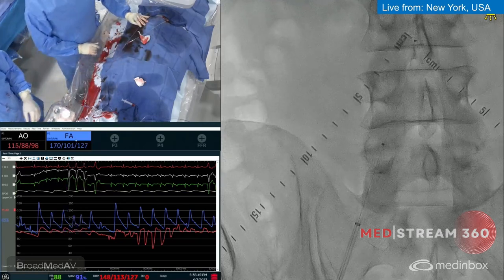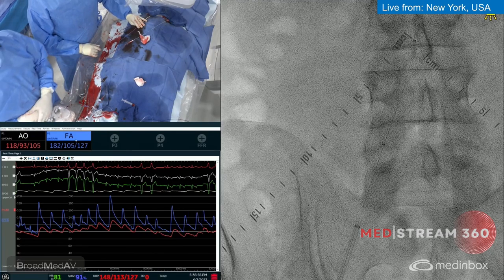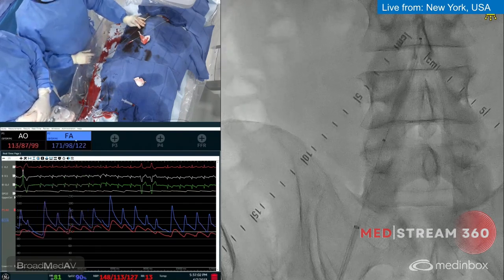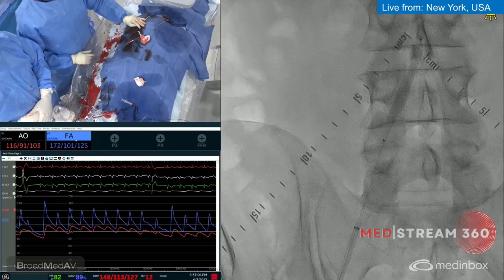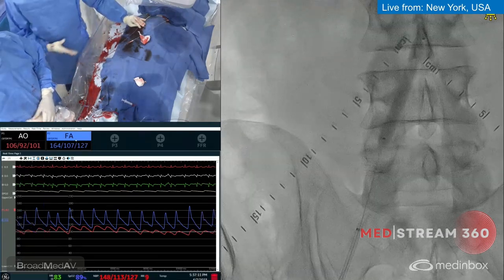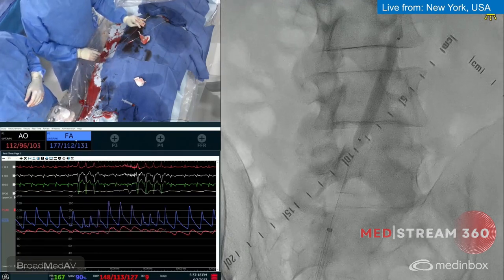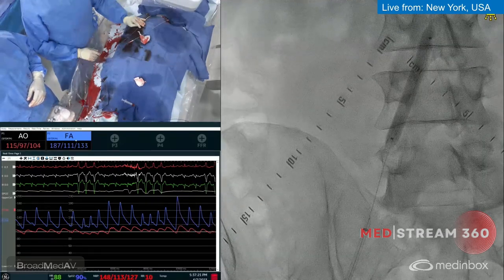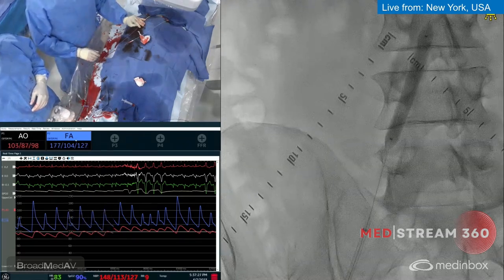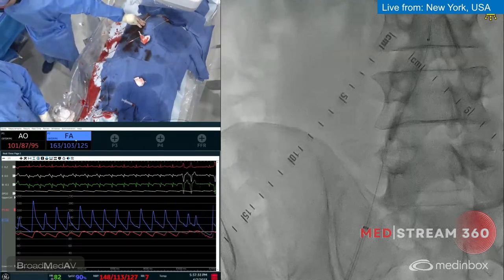We confirmed the patient is on Plavix and Eliquis for AFib, plus heparin, with ACT above 250. Going up now with an 8.0 x 60mm balloon past the centimeter mark. For iliac CTOs, we typically start at a lower ACT around 200, cross, and then go full anticoagulation — though you can start full from the beginning. Going to 6 atmospheres. Hopefully the pressure gradient will normalize, confirming our theory is correct. Now switching to an 0.035 wire.